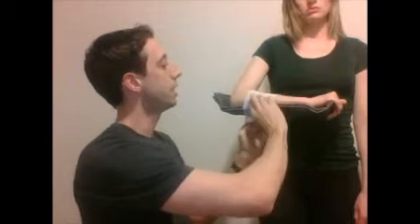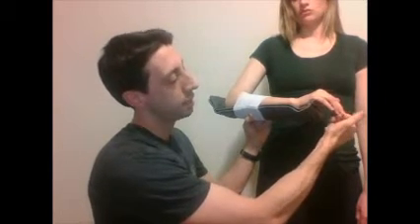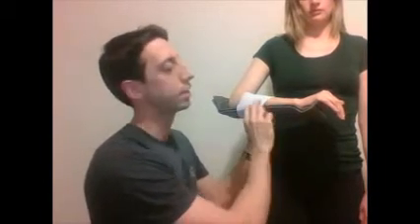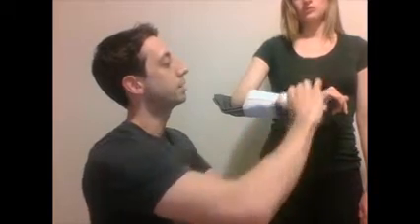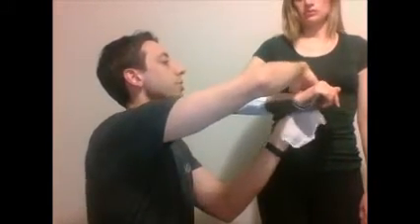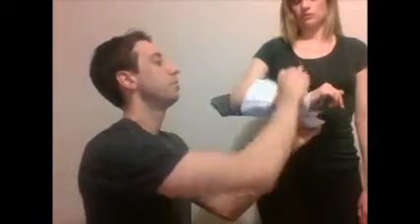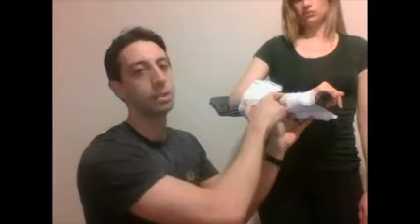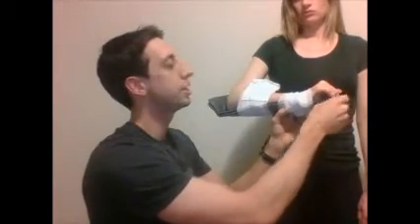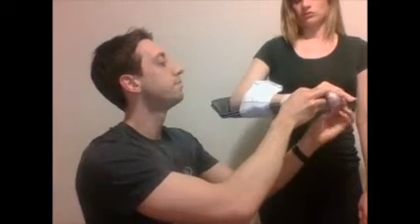Now, ideally, what I would have done here is check for signs of circulation before I start putting this on. So in this case, I'll do a bit of a nail bed squeeze. I can see that it's filling back in less than 2 seconds. I've got good cap refill there. We know that's intact. After I secure this in place with my bandages, going both above and below the injured site, I'm going to do the same thing and recheck. Put my cling around. I've left that area exposed so I can continue to monitor any discoloration, swelling, that kind of thing. I can see it right there. I'm going to recheck for signs of circulation. It's still intact. We haven't cut anything off.